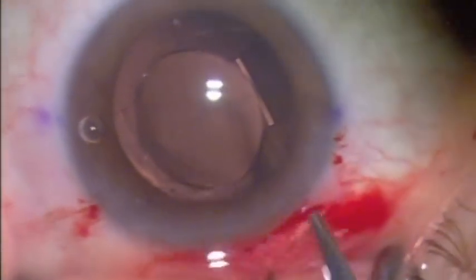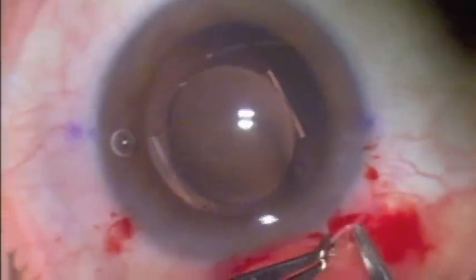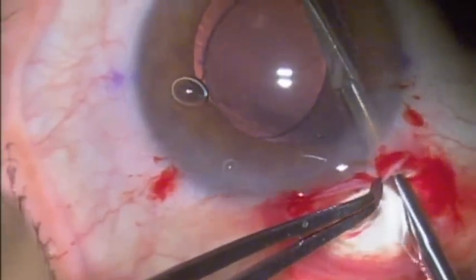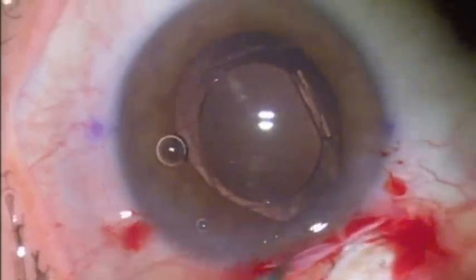I also felt that it would have been quite difficult to manipulate this lens without taking it apart. Here you can see that we've made a scleral tunnel incision on the steep axis, as the patient had about 1.7 diopters of astigmatism.